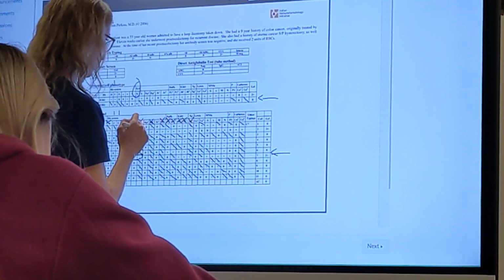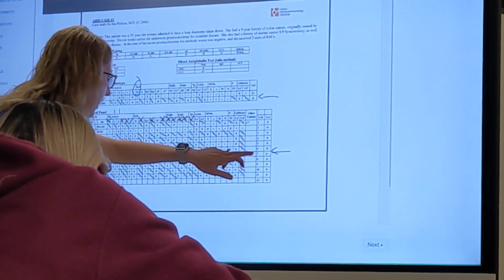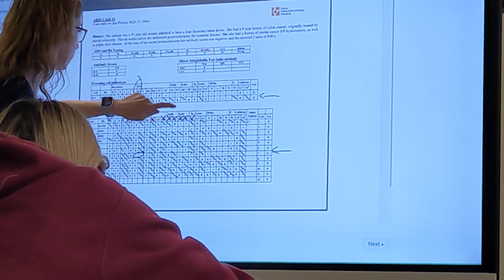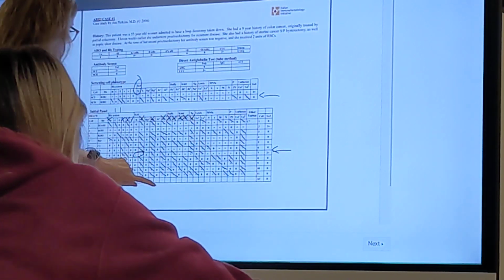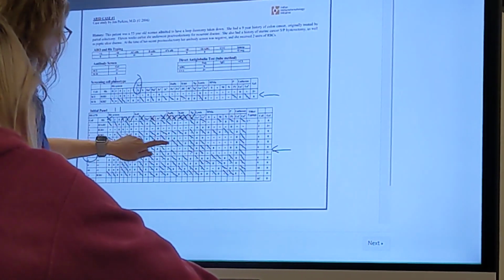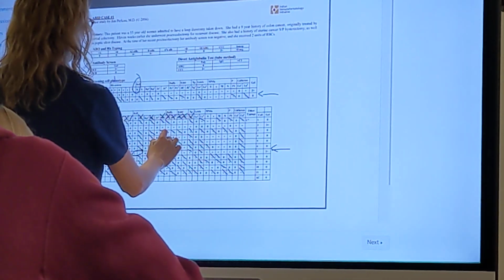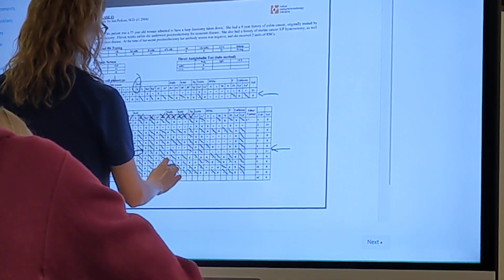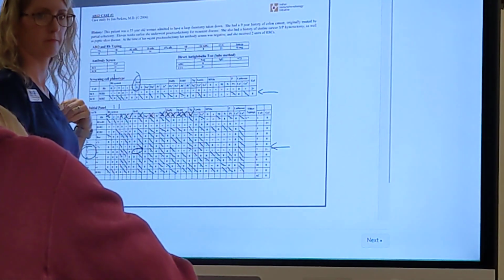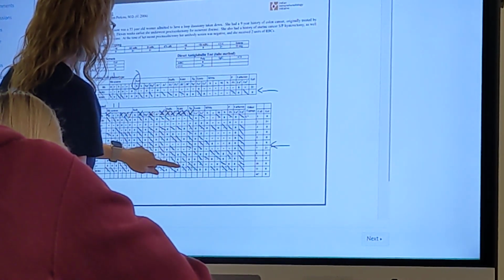How did you get 4 for JkA? I don't know, maybe I messed it up. I did rule out on one cell I wasn't supposed to, so is that why? No, there's one more on top, that's 4. So I got this one, so 1, 2, 3, 4. So I got screening cell number 2, and then what cells? It's 3, 5, and 10. I see what I did. I erased it on 5 and I didn't mean to. So JkB, I ruled that out.